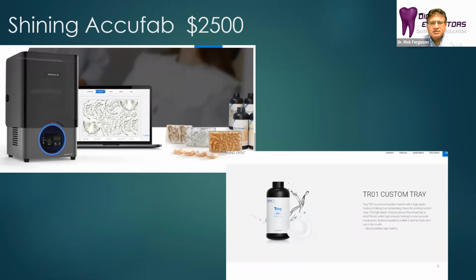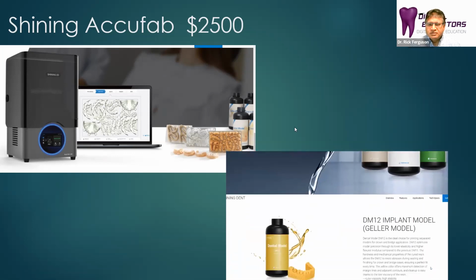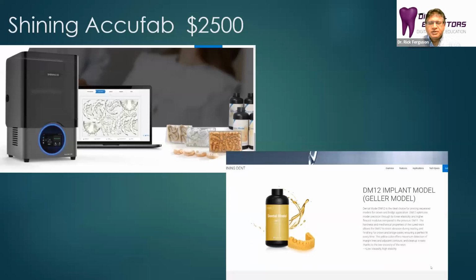But this printer is sort of new to the market, and they have some really good resins, which we are using for making aligner models, and I actually have one of their aligner models here. I've also reviewed that printer on the 3D printing Facebook group. So this is another printer that's available, has a larger build platform at sort of the low to medium price range. And also you should get good technical support from this company.